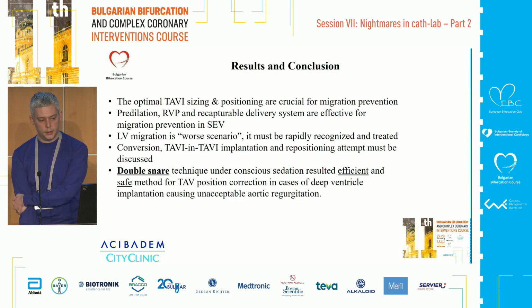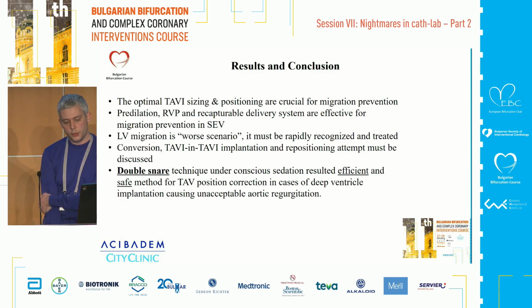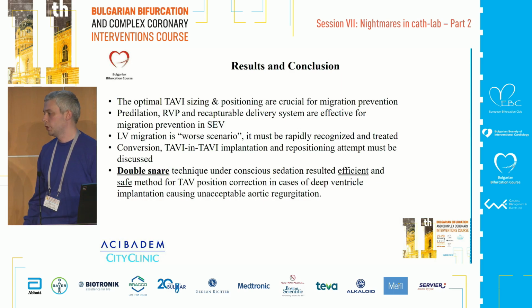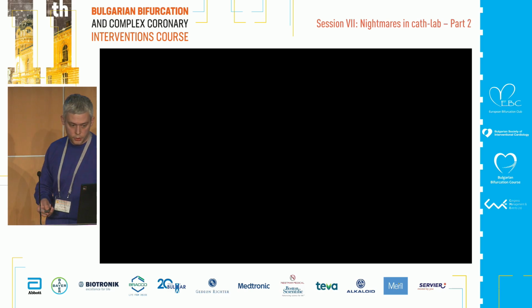We think that the double snare technique under conscious sedation is an efficient and safe method for a first attempt to correct such deep implantation of the valve or embolization. Thank you very much.